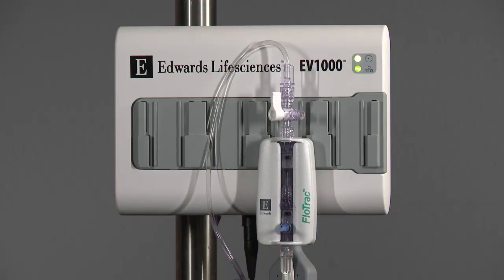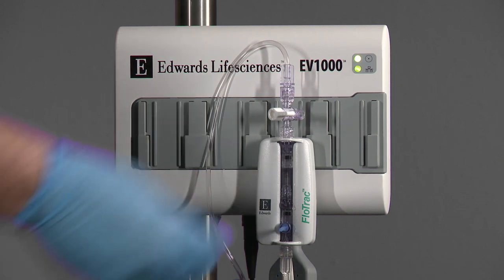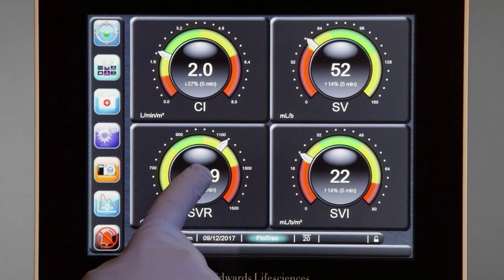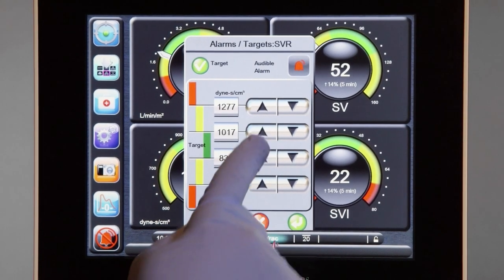Turn the stopcock toward the reference port and replace the non-vented cap. If a patient monitor is connected, confirm the presence of the arterial waveform. Set the blood pressure alarms on the bedside monitor as well as the displayed parameters on the EV-1000.